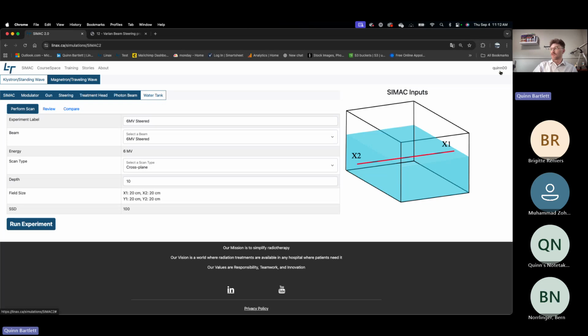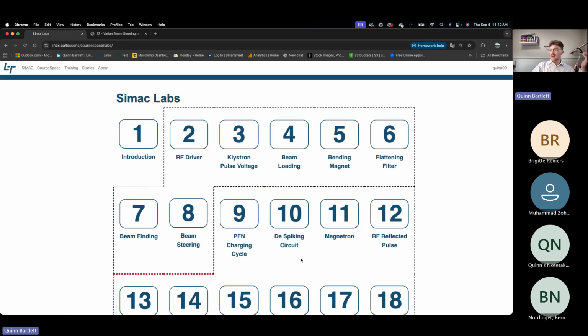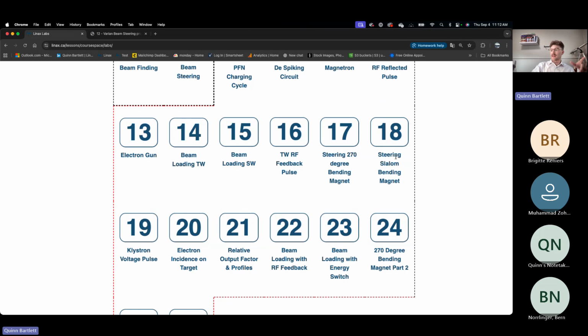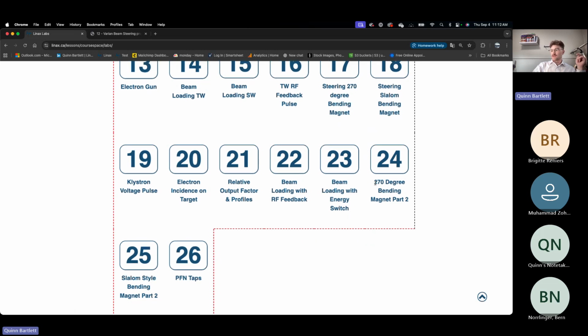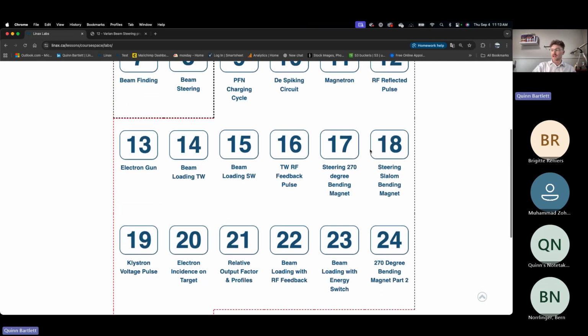I will also show, to get the introduction to beam steering or to do it off the simulator in a more simple way, we also have in our Simac labs, which are located in the course space, steering labs for both the 270 and slalom bending magnet. And I believe we actually have two for each. So we have steering 270-degree bending magnet, 270-degree bending magnet part two. Apologize, no, those are just for bending magnets, but we do have the steering labs here.